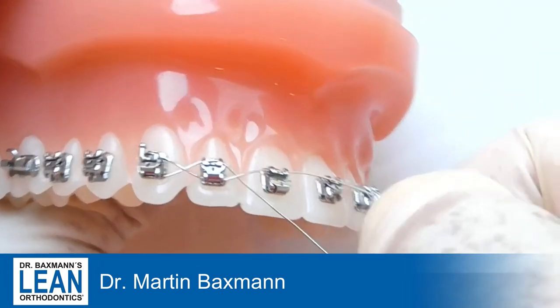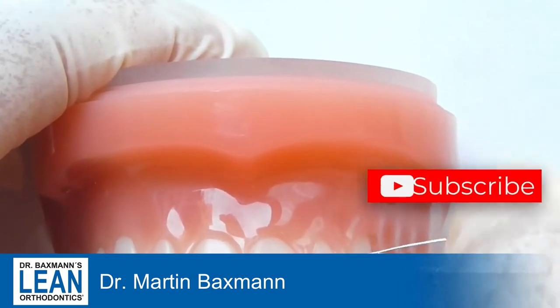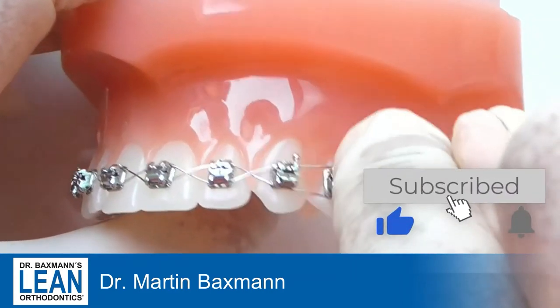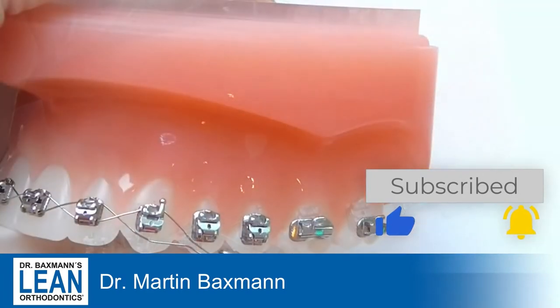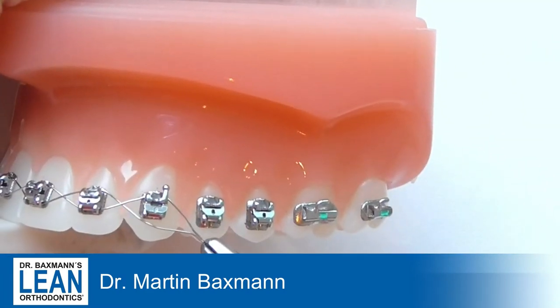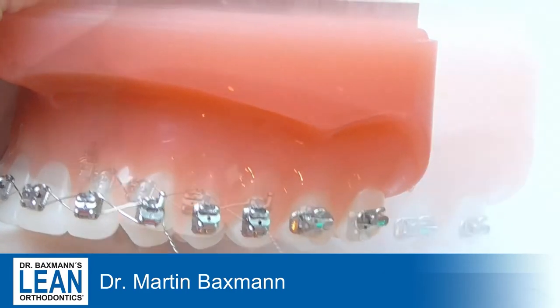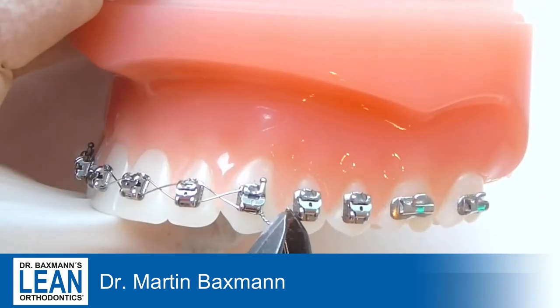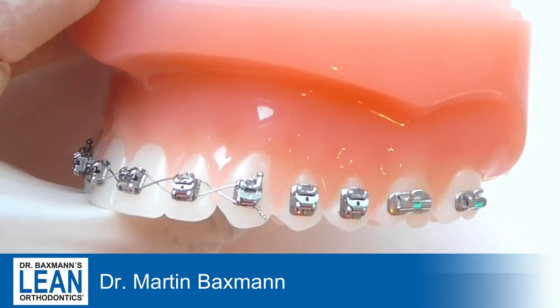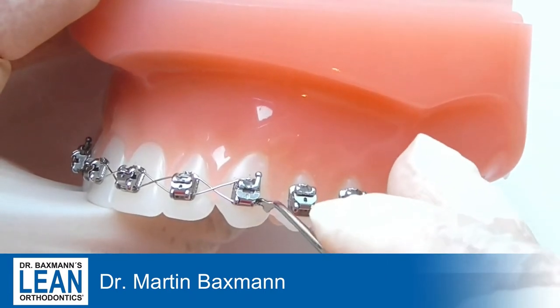What you do is start at one tooth and go up and down like this, up and down again. Then when you've tied all the teeth together that you want to tie, grab your needle holder, twist it, twist it, twist it, and then cut it off. When you cut it off, leave about three millimeters, because then it will be much easier to tuck it underneath the wire with your tucker.